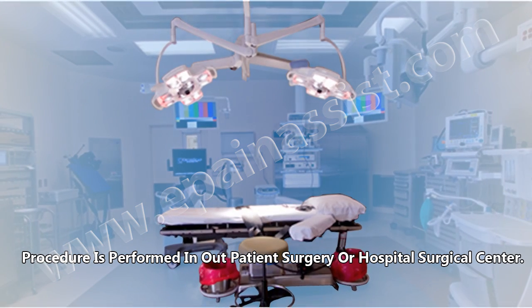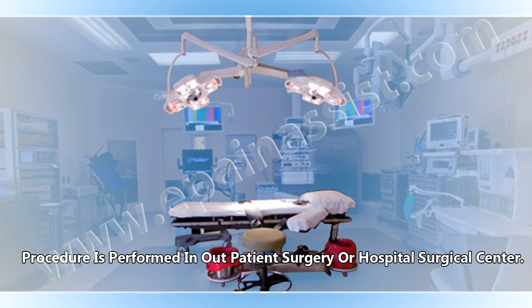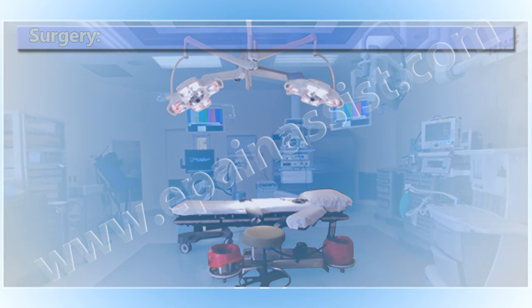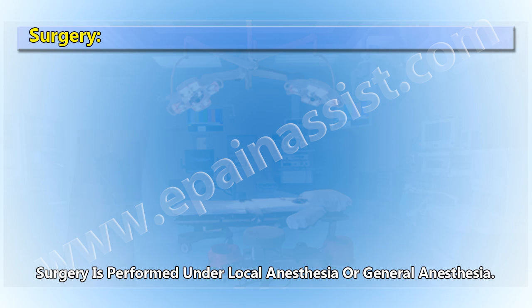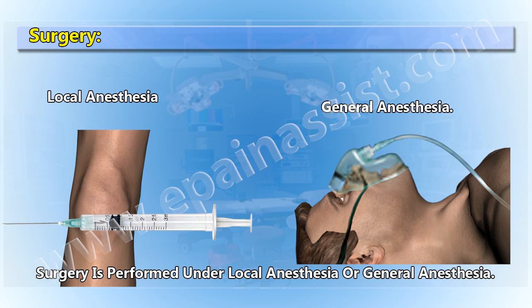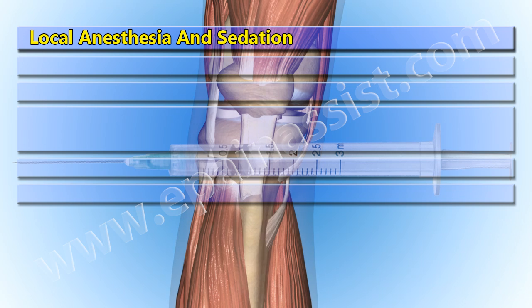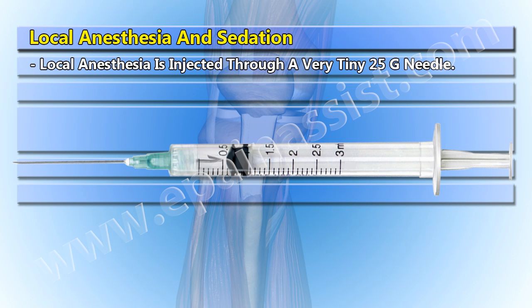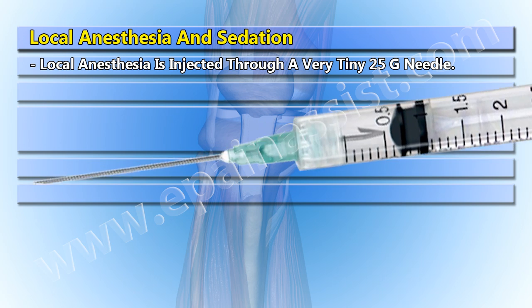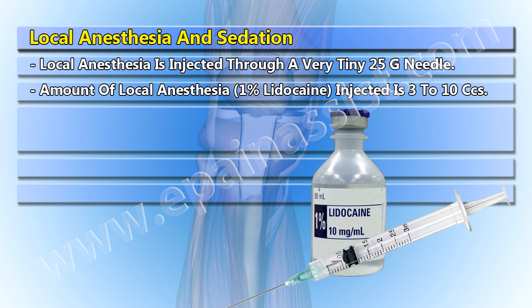The procedure is performed in an outpatient surgery center or hospital surgical center. Surgery is performed under local anesthesia or general anesthesia. Local anesthesia is injected through a very tiny 25G needle, with 1% lidocaine injected in amounts of 3 to 10 CCs.